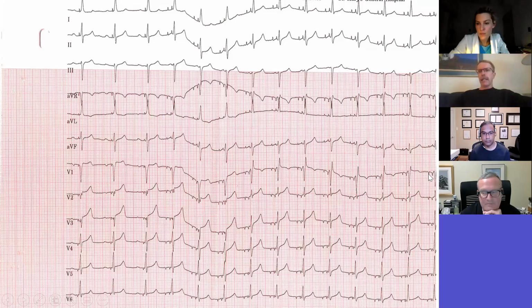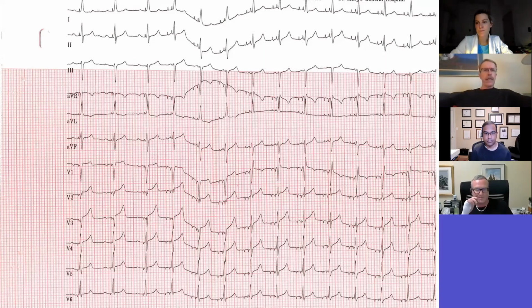Now, I think there could be multiple mechanisms, but it's quite common to see. If you don't see an R prime, there's multiple reasons. One is you may not get it. In 10 or 15 to 50% of patients, you just get a QS, a very narrow QS in V1. So the question is this: capture of the right bundle with the ring? Is it some interconnections? Is it just myocardial capture near the base that heads up to wherever the R prime comes from, I assume, from you guys who map hearts? I don't do EP studies, but is it just myocardial depolarization, muscle to muscle, depolarizing that area at the base, in the outflow kind of area? So what do you think is the mechanism of this?